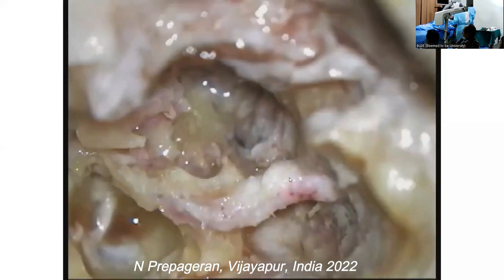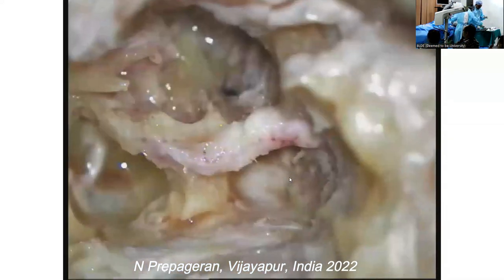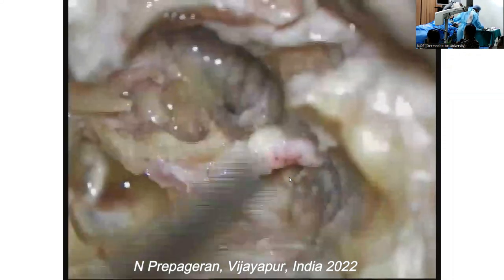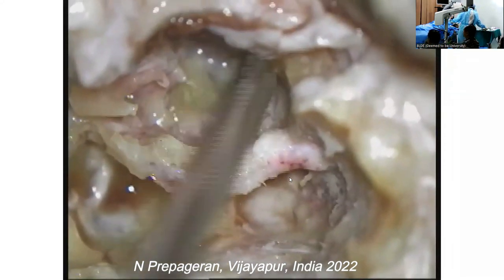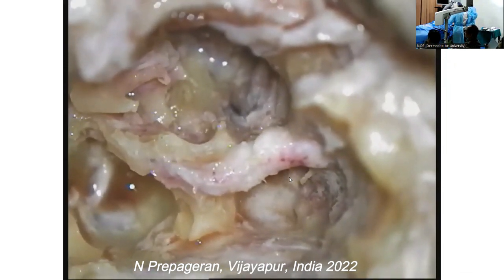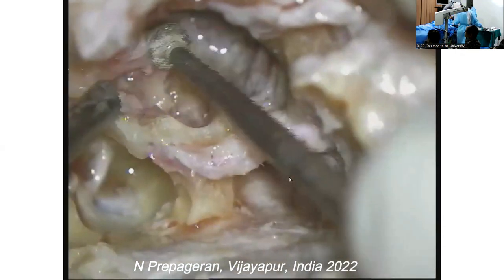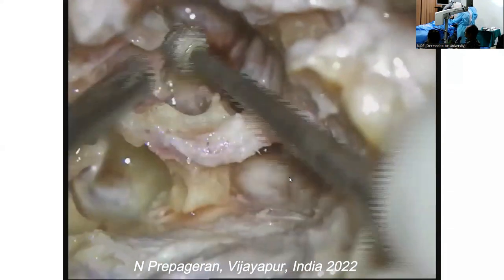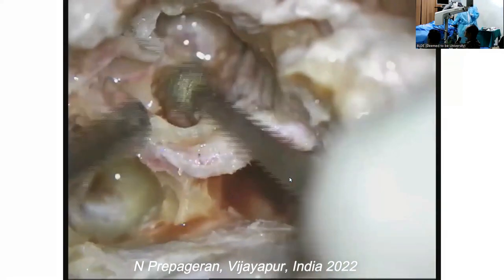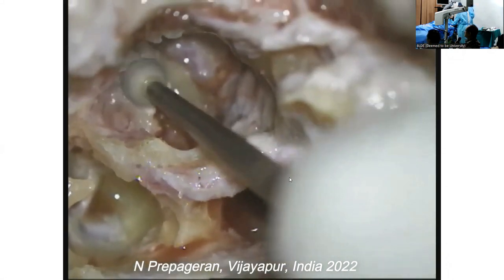If you've got a diamond. Can you hold the head for a while? Diamond. So that's the basal turn. Okay, so now, can you hold the head, I guess? So now, let's go to the second turn.